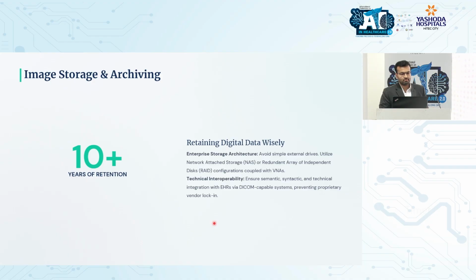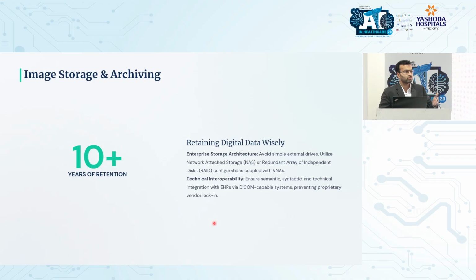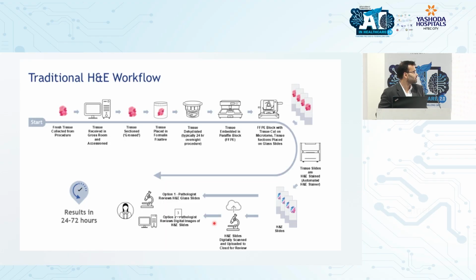Data storage, I don't know if NABL has given any guidelines for how many years the data has to be stored. This article suggested 10 years is what they've suggested. NABL suggests right now, not on the... Yeah. But then the point is you have to factor in that you need to store data for 10 years or 15 years. Workflow is right now this much, workflow may increase to this much, figure out your storage accordingly. Storage becomes expensive once you have to scale to that many slides.